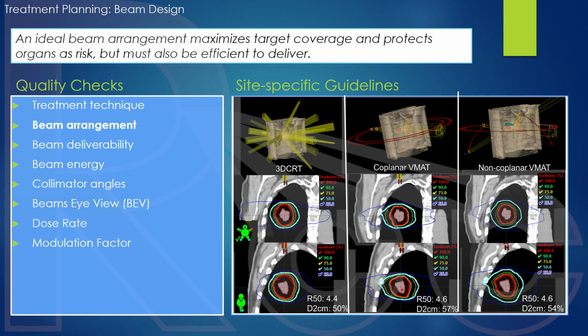What I'm suggesting to you is that we need to pick the gantry angle where the beam first encounters the target, and then beyond the target is the organ at risk. That is, we're a little bit lower down on the percent depth dose curve by the time we reach the organ at risk, and therefore the dose to the organ at risk is lower than if we selected the opposite opposing angle, where the organ at risk would be hit with a higher dose, higher up on the percent depth dose curve, followed by the target.